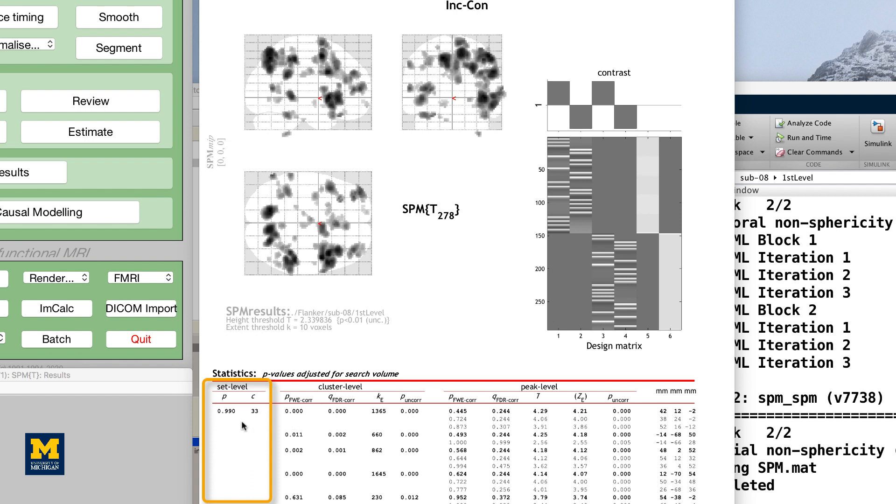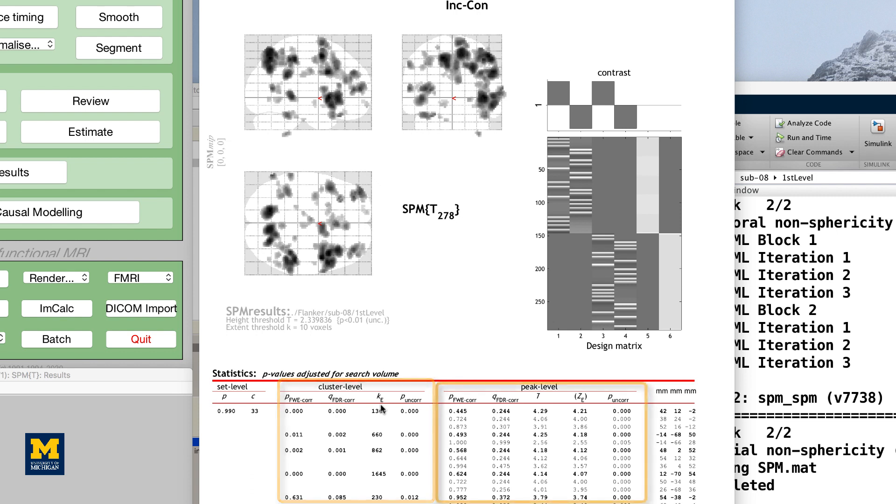The first column, Set Level, indicates the probability of seeing the current number of clusters, C. The Cluster Level column shows the significance for each cluster, measured in number of voxels, or KE, using different correction methods.